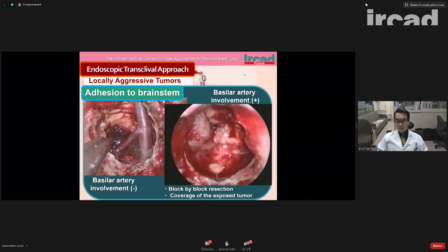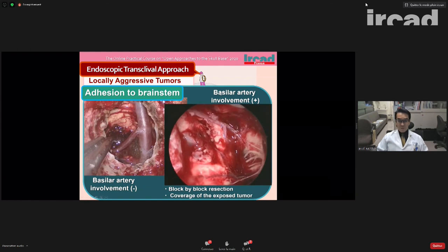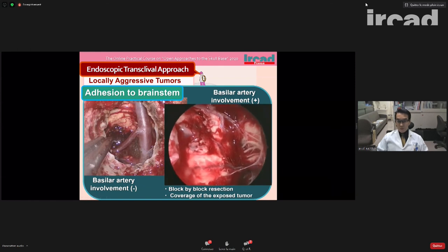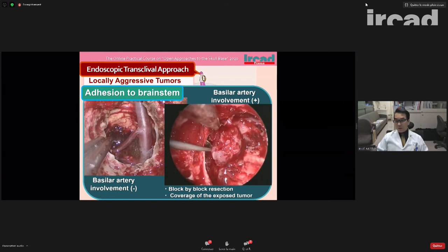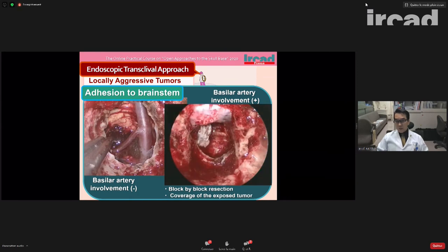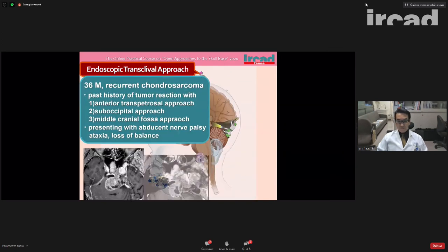And also, if there is a residual tumor like this, I think we should cover the residual tumor with non-absorbable material like the fascia or something like that. Because if we expose and leave the tumor in here, maybe it can be a dissemination. It can cause a dissemination. So we should cover it. And I think it's quite effective to prevent the dissemination.